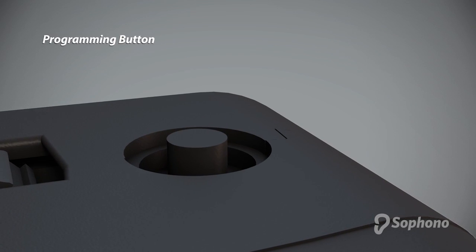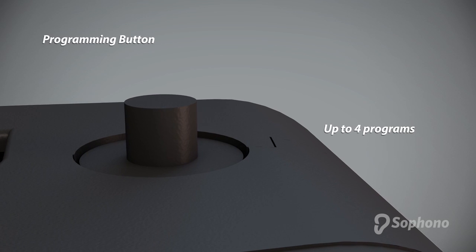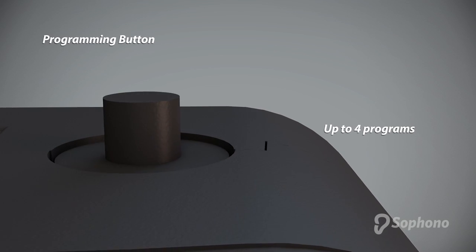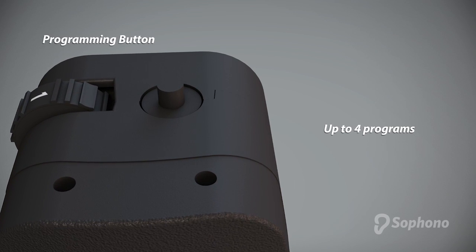Press the programming button to change programs. The device can have up to four programs. Cycle through the programs by pressing the button. You will hear a tone each time you change programs.